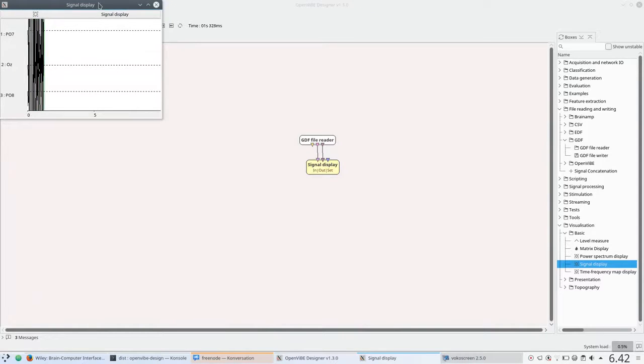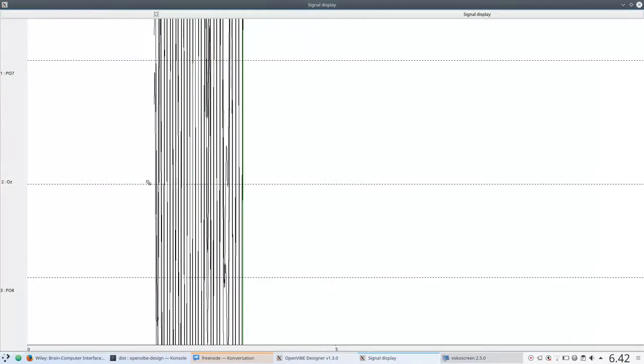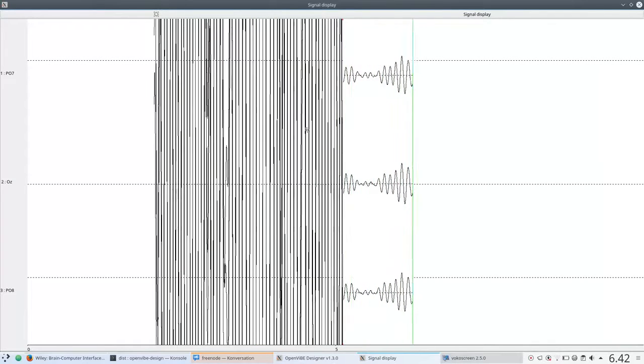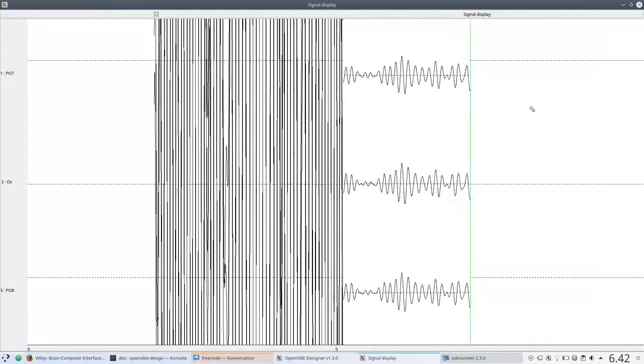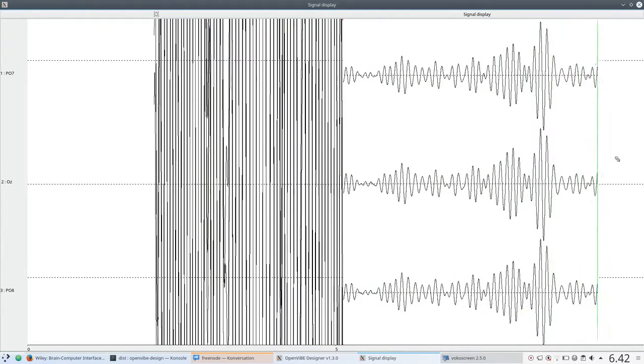It's a little bit erratic at first, but once things stabilize, you can see this is normal EEG rhythm.